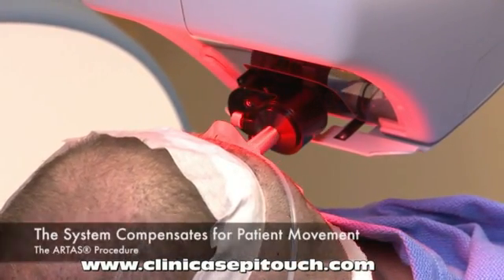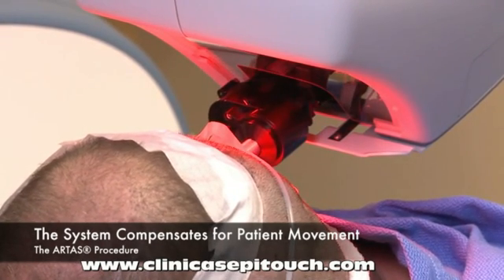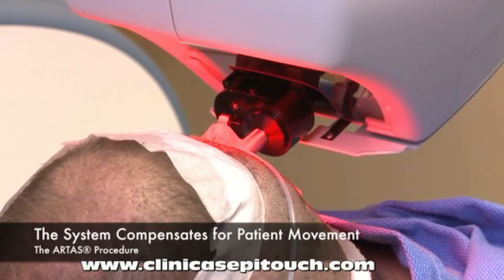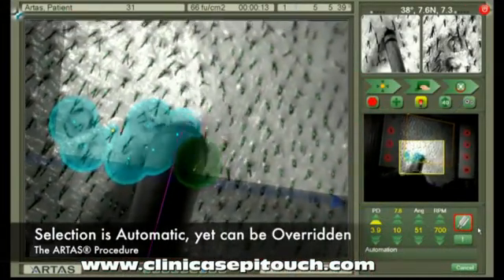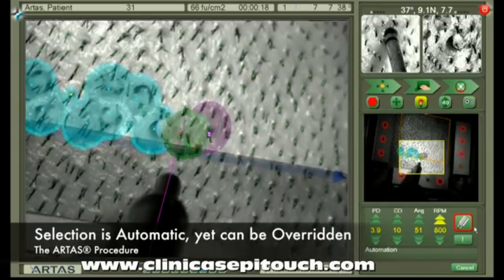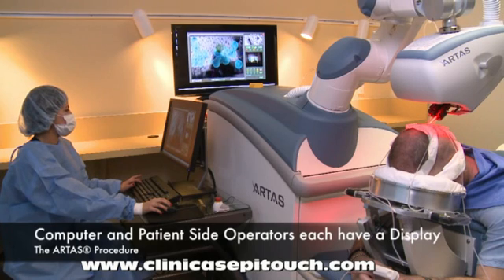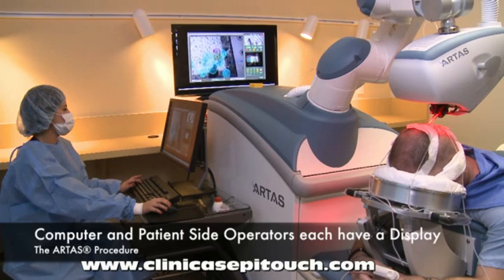Patient movement is inevitable, so the system was designed to track and compensate for patient movement continuously and automatically. The selection process is automatic; however, it can be overridden at any time by either the patient side or computer side operators. For maximum situational awareness, both the computer side and patient side operators have a display on which to monitor the dissection process.